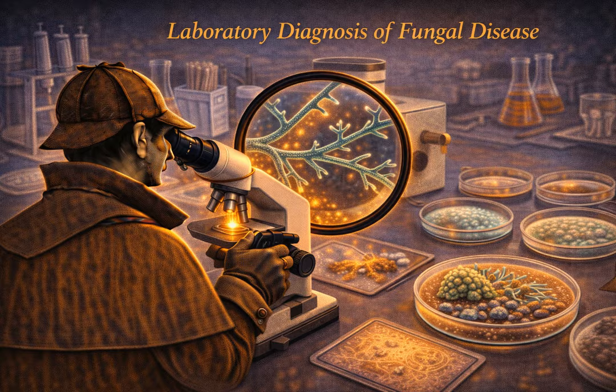Right. This is usually something like brain heart infusion agar, BHI, or SABHI, which is Sabouraud plus BHI. These are extremely rich, nutrient-dense agars. They often have sheep blood added to them. Non-selective means exactly what it sounds like. We aren't trying to stop anything from growing. We want to catch absolutely everything in that sample.